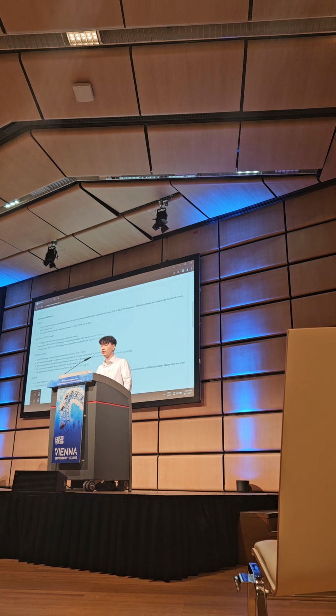After the images were acquired, we resampled all PET-CT images to a voxel size of 2 by 2 by 1.5 millimeters for computational reasons. All early-phase images were rigidly co-registered to the corresponding delayed-phase images using statistical parametric mapping. Of course, we performed augmentations including, but not limited to, random rotation, random elastic deformation, and random cropping.